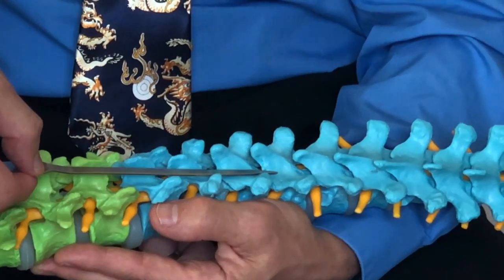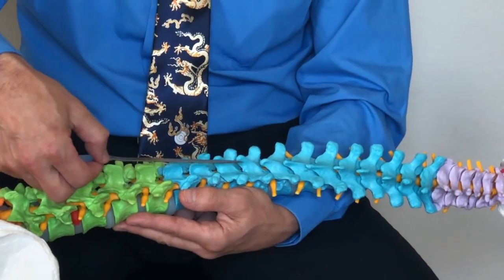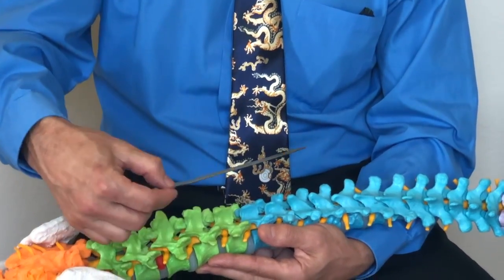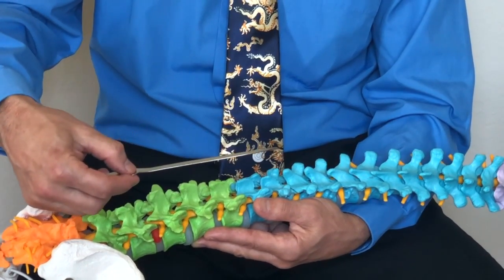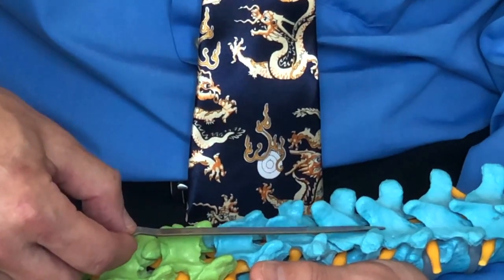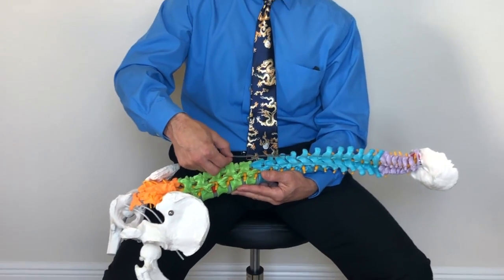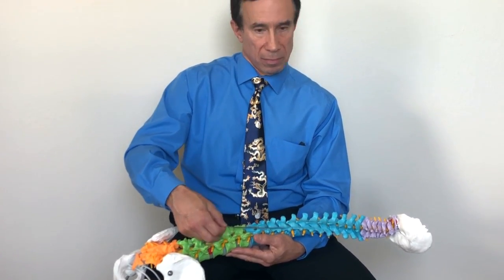Once the electrodes reach the planned location, stimulation is applied starting at a very low level and slowly increased until the patient begins to feel stimulation. At that point, communication is essential in order to ascertain whether the stimulation is being felt by the patient in the same area where the patient normally would feel pain.